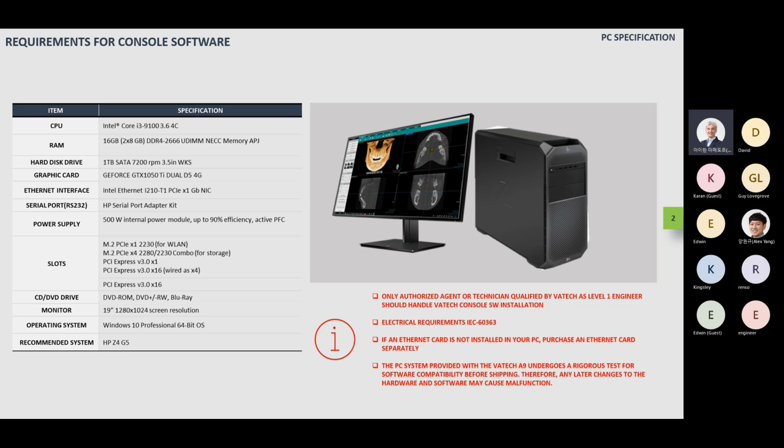And of course, the console software installation requires a little bit more skills. I guess most of you must have it if you have experience already with installation of other VATECH equipment, so it shouldn't be much difficult for you to do that.